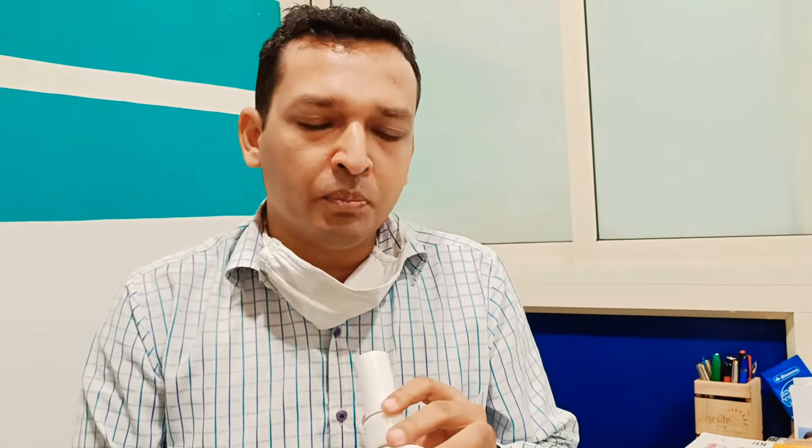Do not lean forward too much. If you bend excessively, your glottis will close — the glottis is where the breath goes out — and once it closes, you will not be able to blow out effectively.